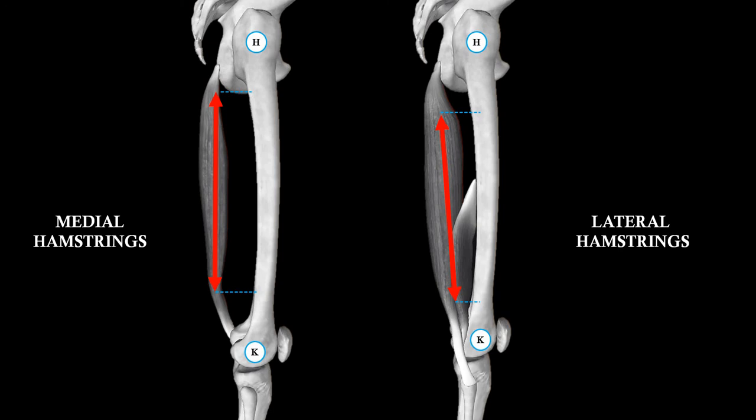So pros and cons. As a pro, it's non-invasive. We don't have to stick a needle in you. We can put a sensor. There's a bit of dignity lost with being shaved and so on, but that's a small price to pay. It's better than having a needle inserted in you. So it's a non-invasive technique. It's very easy to apply.